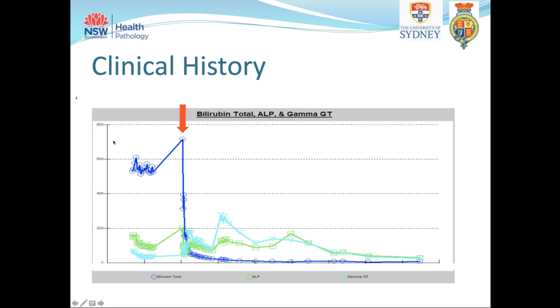The Perls stain does stain a little bit of iron, but not that red-brown pigment, and the orcein stain was completely negative. On polarization, the liver, in fact, showed an unusual property of yellow-red birefringence, shown again here. And I won't go into too much detail. As I said, this is a fun and interesting case of erythropoietic porphyria. If you haven't seen these classic Maltese cross inclusions, this is a very nice example.